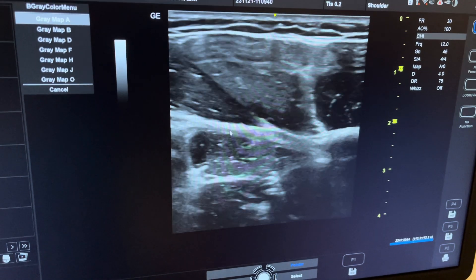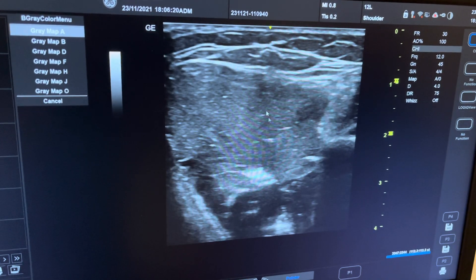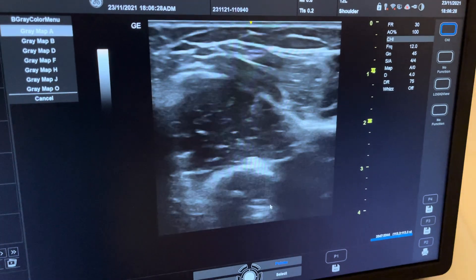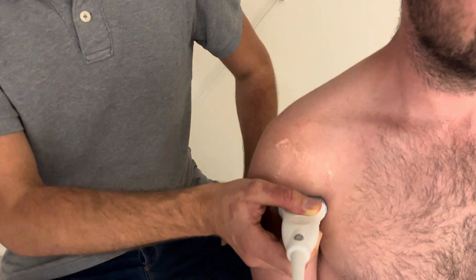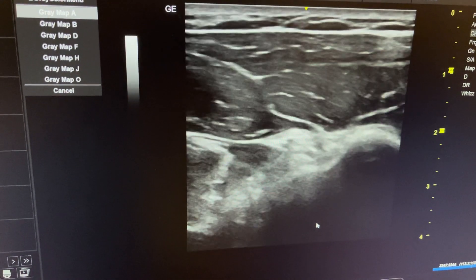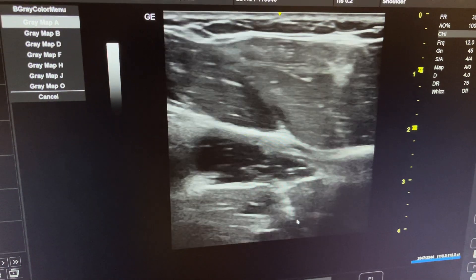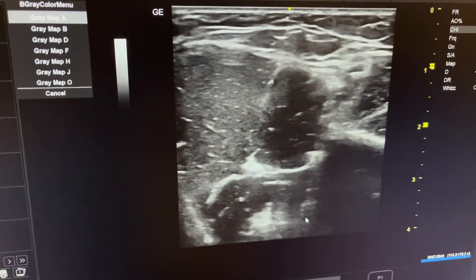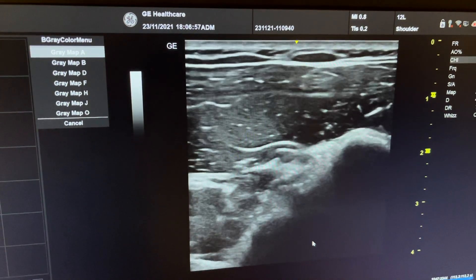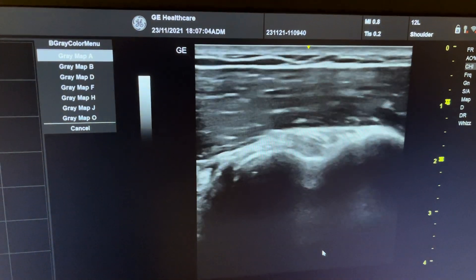Going a little more distal, the two muscle bellies fuse together — now this is all biceps. You can even see the musculocutaneous nerve deep to it, appearing a little more hyperechoic. Going back up, we return to the intertubercular groove. This is a technique we call the 'elevator technique' — practice it by scanning a bit faster than usual, making it as dynamic as possible.